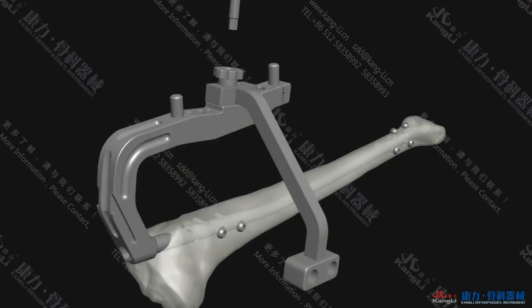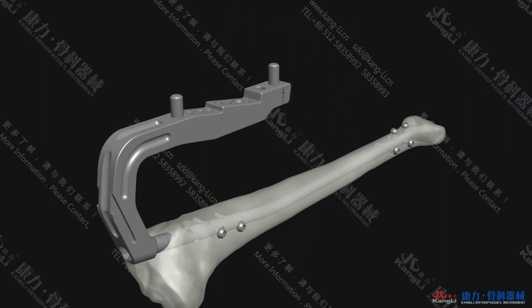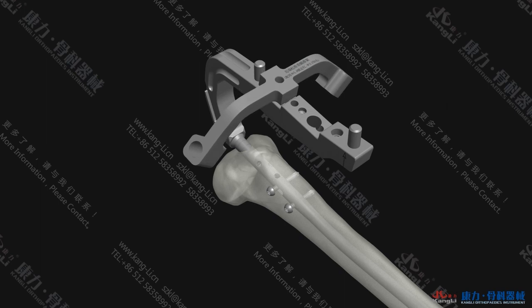Remove the proximal targeting bracket. 3 Φ5.0 locking screws could be placed at the proximal end of the nail of the KTO Tibial Intramedullary nailing system, according to the requirements by the type of the fracture. The detailed operations are as the following. Install the proximal cancellous bone targeting bracket on the holder and screw tight with the proximal targeting bracket lock wheel.